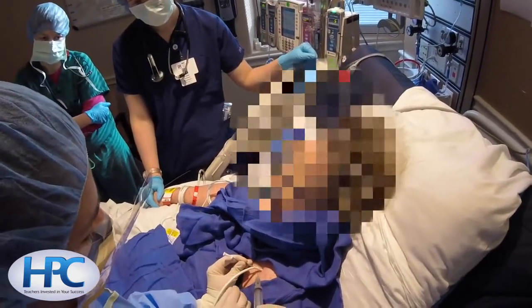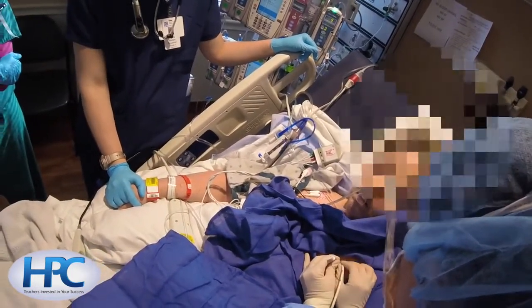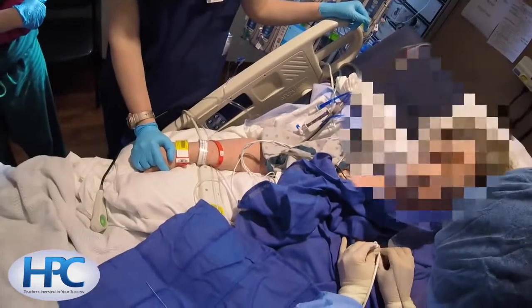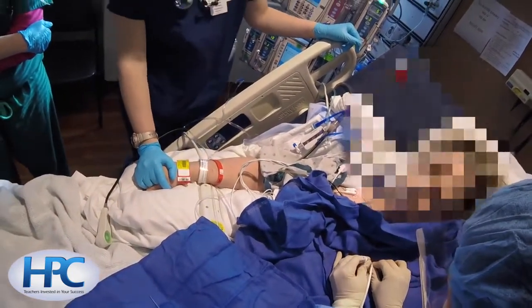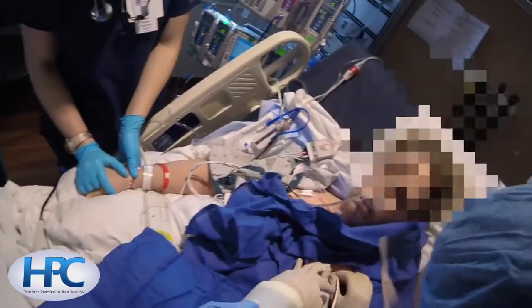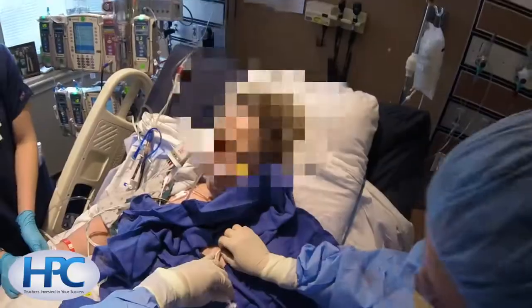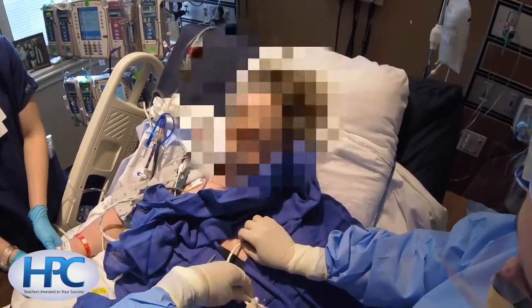Again, more lidocaine is used to help the catheter pass more easily in through the subcutaneous tissue and into the pleural space. Once the large hole of the pigtail catheter is at the skin, the gray dilator can now be removed, as is shown there, and then the pigtail catheter is advanced to the last black line.